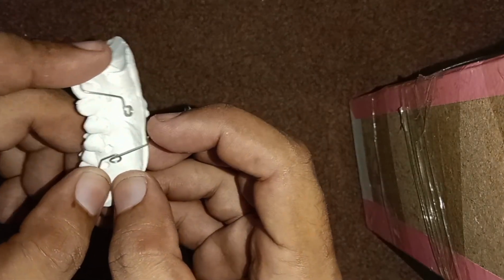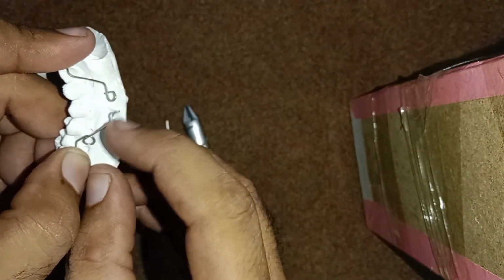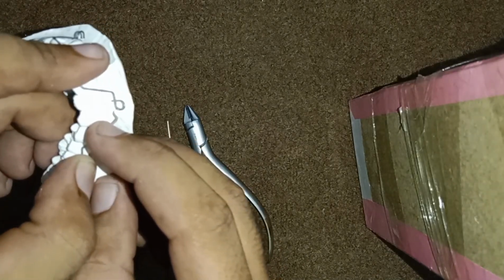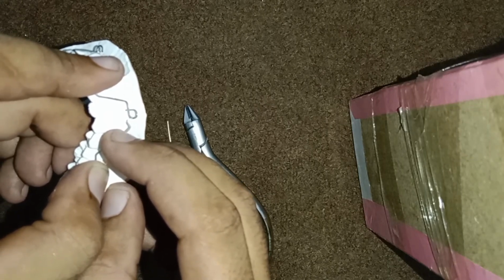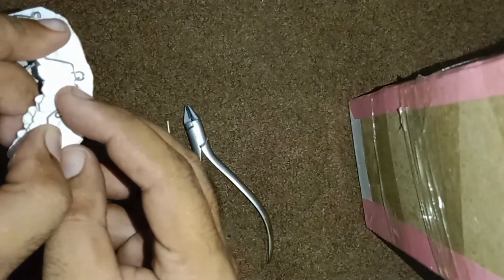Because of the activation bend that we have given, we will bring it upward and place it in this hook. This way it will press the anterior segment in the downward direction and it will be activated for the intrusion force.